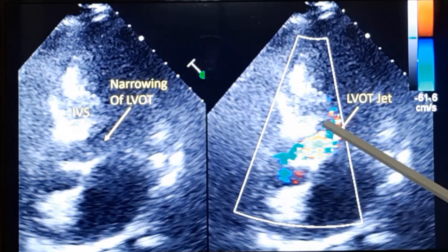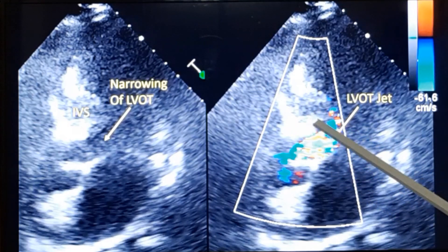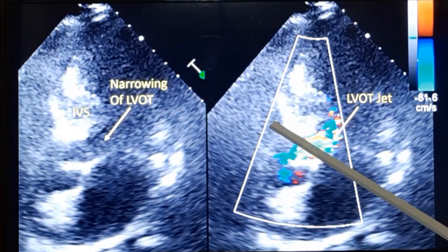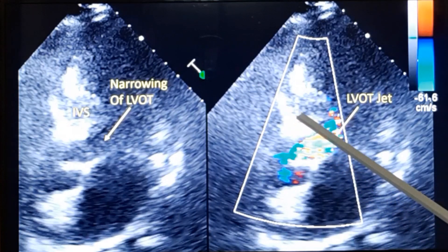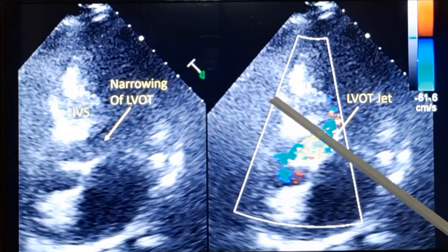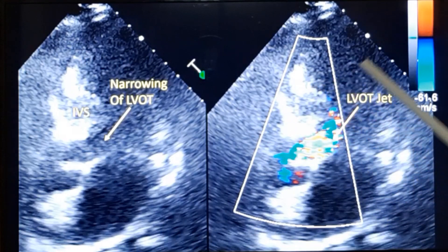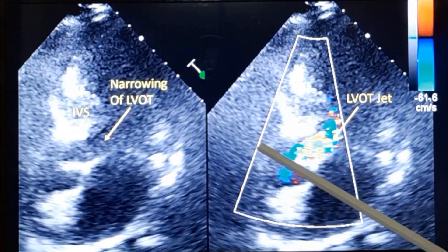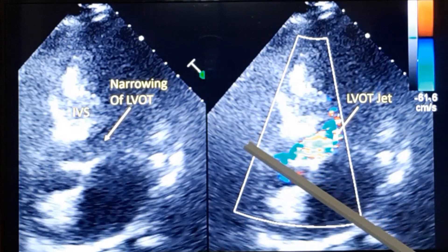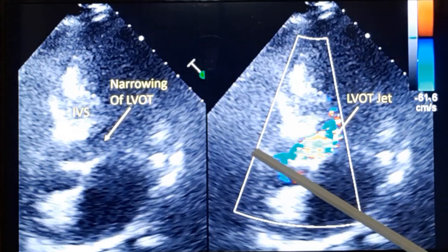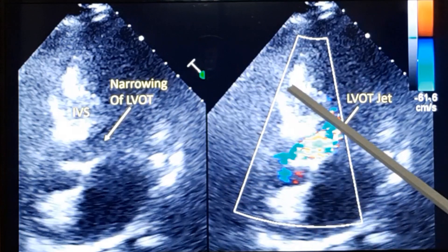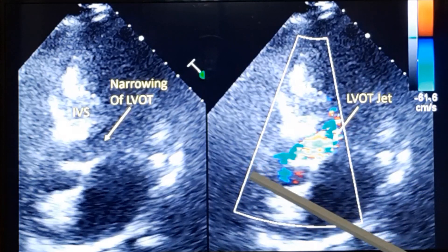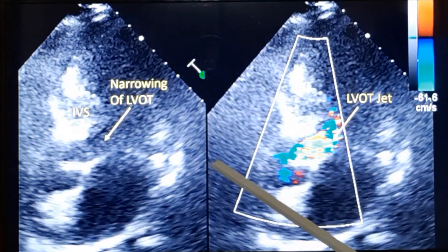When you measure the thickness of the septum, you have to check in multiple views and measure the maximum thickness for calculations. The ratio between septal thickness and posterior wall thickness is important in assessment of hypertrophic cardiomyopathy. In the parasternal long axis view you will get the posterior wall — note that the lateral wall should not be confused with the posterior wall.